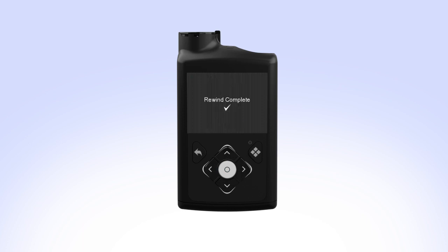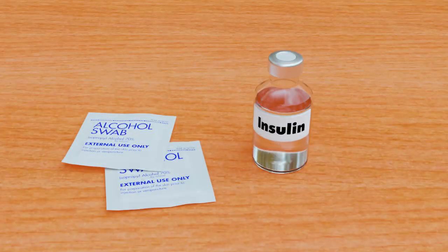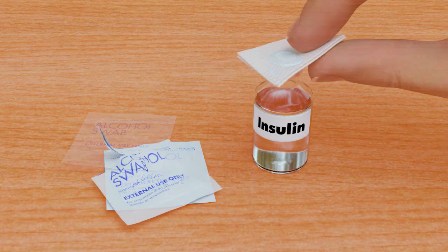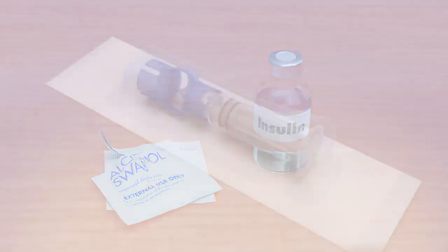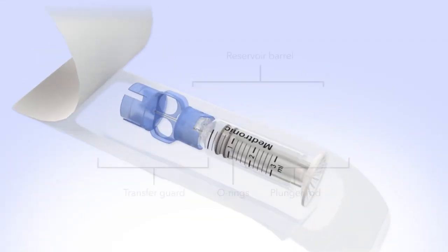Rewind complete appears when the piston has rewound. You can now set the pump down and prepare to fill the reservoir. To reduce the risk of air bubbles, make sure the insulin vial is at room temperature. Wipe the top of the insulin vial with alcohol and wait until it dries. Remove the new reservoir from the package.